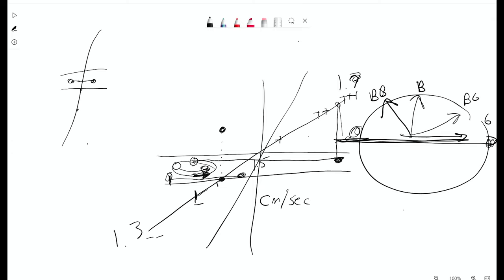That was right. One of the only times that we are using vessel wall MR is for hemorrhagic plaques, right? Just because CT struggles with that. So there's been a benefit that we've seen in our practice with it. But you're using dark blood. We're using dark blood, exactly.